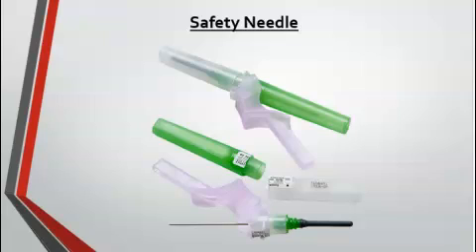This image is here to mainly show you the safety that is included with your needles. The top needle is showing you with all the caps and safety included on the needle, and this image below is showing you the needle with the two caps taken off. So within this green cap is the side.